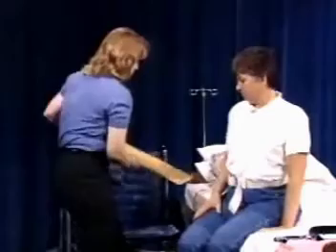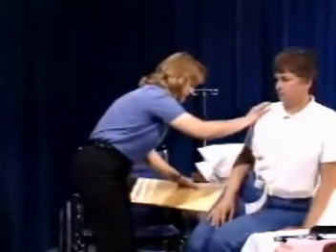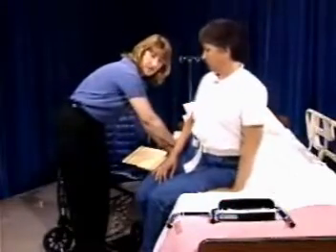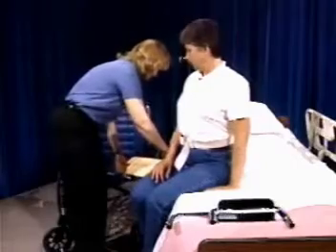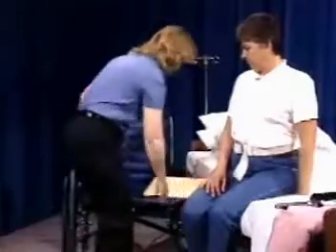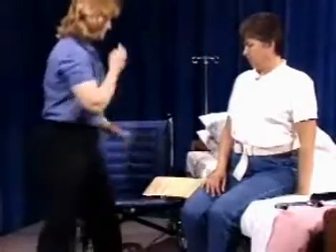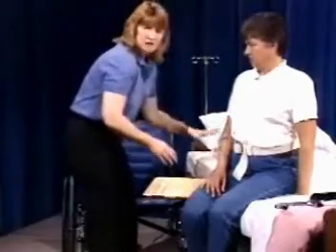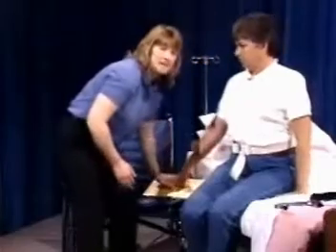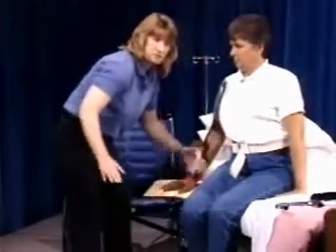With the sliding board, all I'm doing is asking her to shift her weight to the opposite side, and I place the sliding board underneath one side of her hip. Now you can see that it's spanning that gap. I make sure that the chair is in a good position and that the chair is locked so that it won't scoot away from us. And then I'll just explain to the patient that I'm going to help her with the safety belt and she needs to place a hand on the sliding board so that she can help to push and scoot herself across.